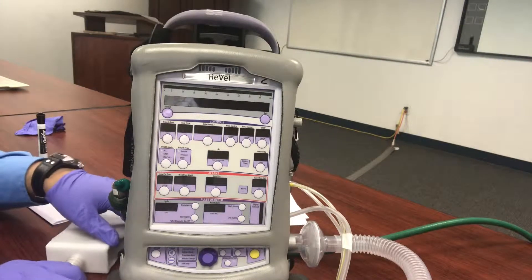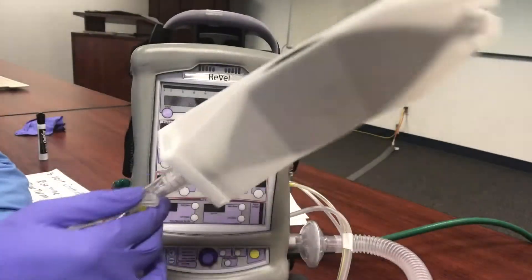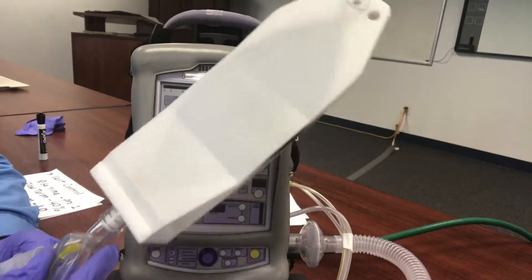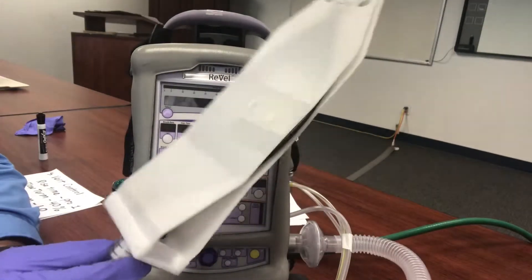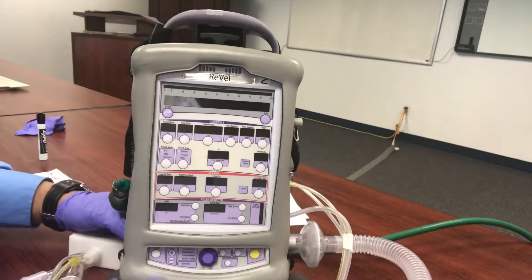The first thing we should always do when we have our travel vent is we need to have our test lung. It's very important that when you're making your settings and dialing in for the ventilator — especially for BiPAP — we need to set it with a test lung just to get everything ready. So let's go ahead and fire up our Revell.